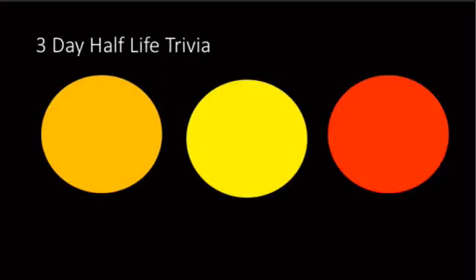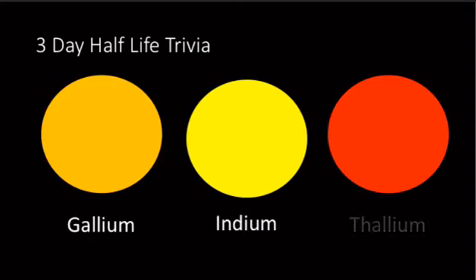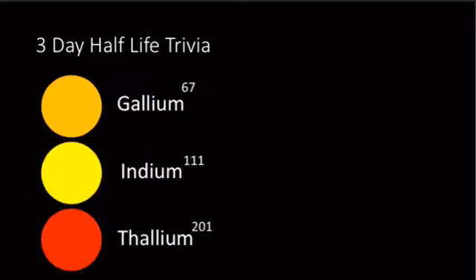So I mentioned there's multiple tracers that have a half-life of around 3 days: gallium, indium, and thallium. Okay, so GIT, G-I-T. All right. Now I have a way to remember that.